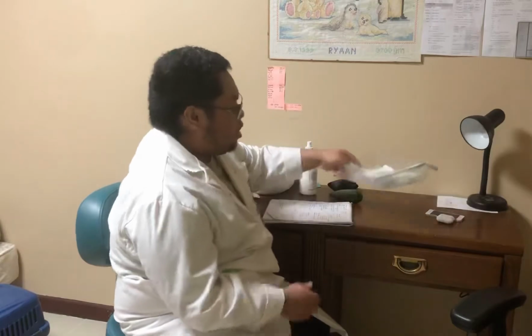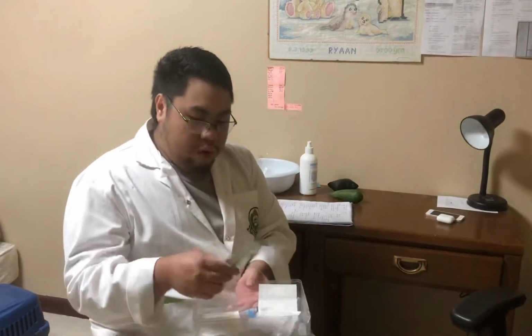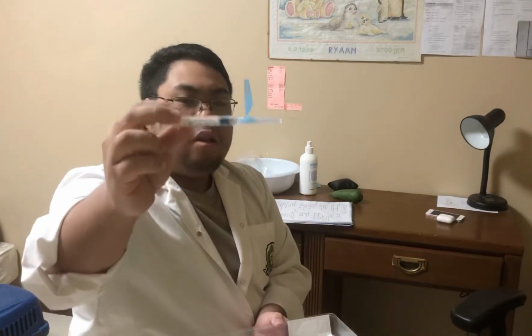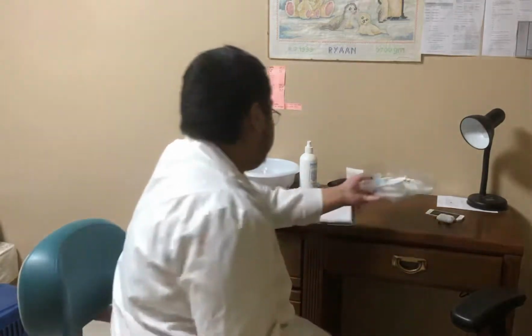sample. So now, in our ABG kit, we have our povidone iodine, our pre-heparinized injection 3cc with a 20 gauge short bevel 1.5 inch needle, and also just in case your 22 gauge bevel with a 1.5 inch needle, your sterilized gauze, your band-aids, your alcohol swabs, and your heparinized solution if it is needed to heparinize, but this one is pre-heparinized, and also your syringe cap in case to cover it up.